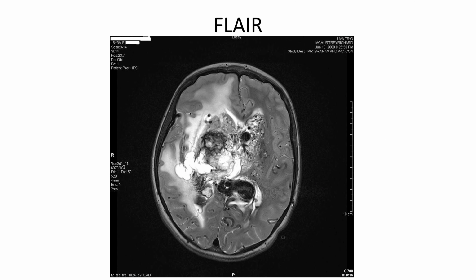Lastly is one of the most interesting cases that I've seen. This was a 16-year-old girl, who was surprisingly normal, only slightly delayed in school, and had started having her first seizures. And once we did imaging in the brain, we quickly realized things were not even remotely close to normal. This is a giant arteriovenous malformation. And amazingly, the neural tissue was intact enough that she functioned fairly normally despite this massive malformation of the vasculature.